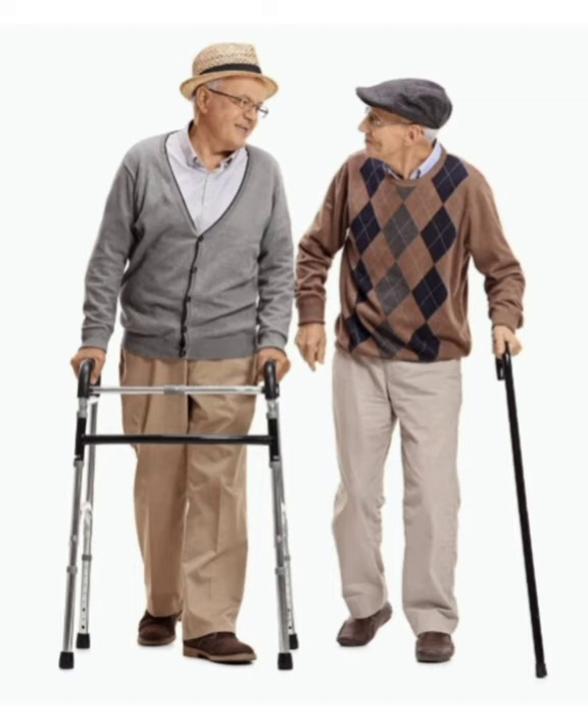Now that we have covered the common assistive devices used for balance, you may wonder: should I or my loved one use one, and which one should be used? If you or your loved one has had several falls due to loss of balance, it may be a good idea to start using an assistive device. Reviewing from least to most supportive, a single-tip cane would be the first line of defense. If that option doesn't work, then a quad cane or walker could be used for more support.